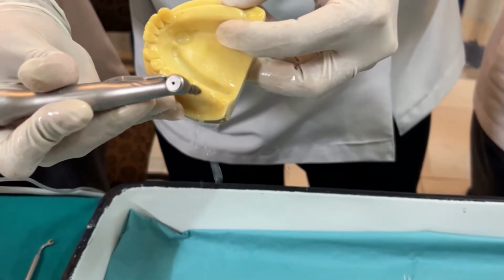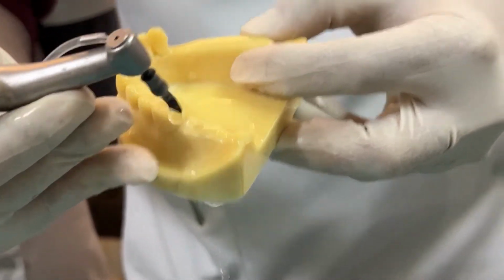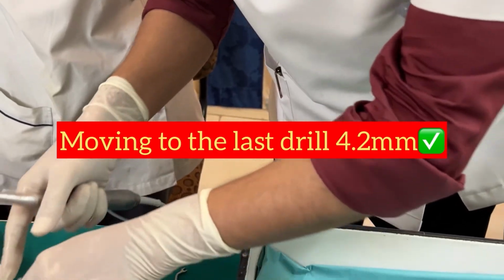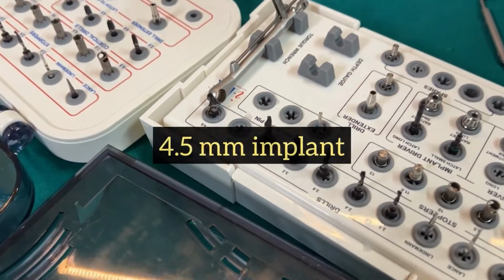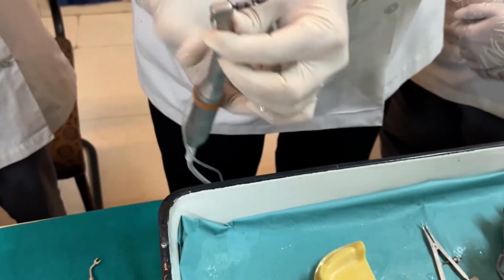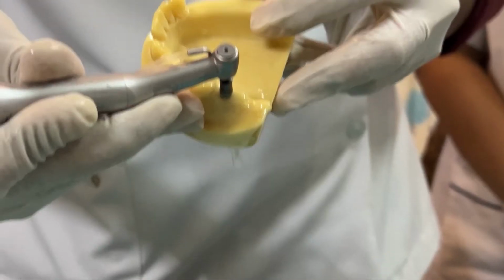So now again, so this is sequential atraumatic preparation, and now we move on to the last drill, that is 4.2. So why 4.2? Because I am planning to place a 4.5 millimeter implant. Okay. So now with 4.2 drill, I have attached the drill stopper again, and we are just finishing off the preparation with 4.2.